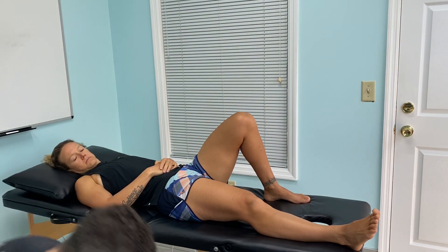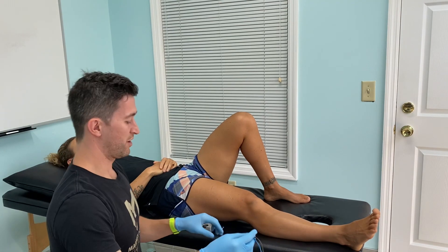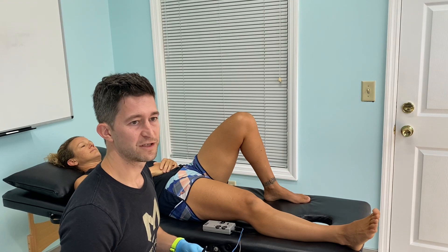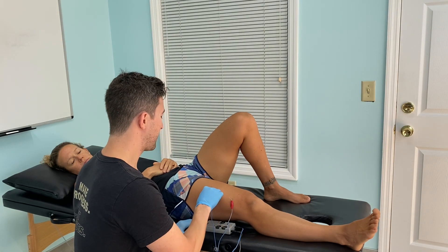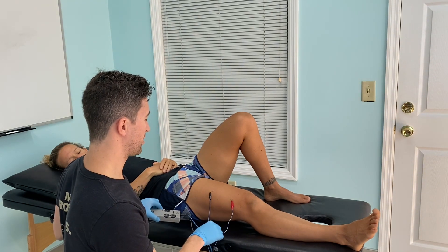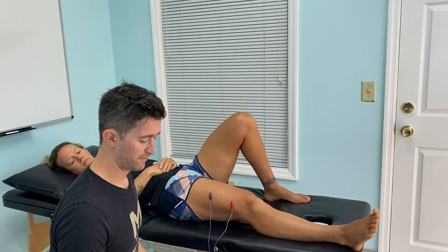This is also something I'm using quite often for recovery with patients. So if you are post 5K, post 10K, half marathon, marathon, something along those lines, and you are really sore, I'm going to use the same general setting here to get the muscle pumping. Basically it's going to reduce your delayed onset muscle soreness and give you a little bit less soreness post hard workout. Now we've got the needles on and I like to use a 3-10 alternating frequency here.